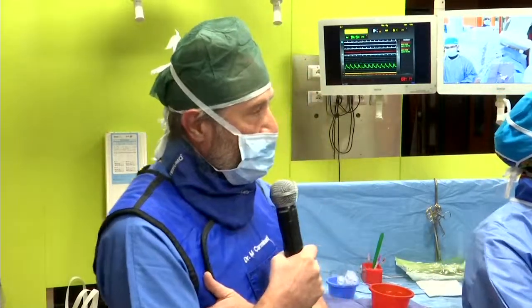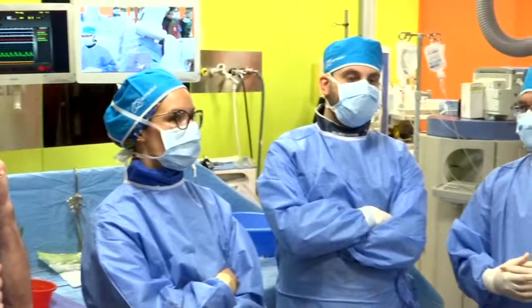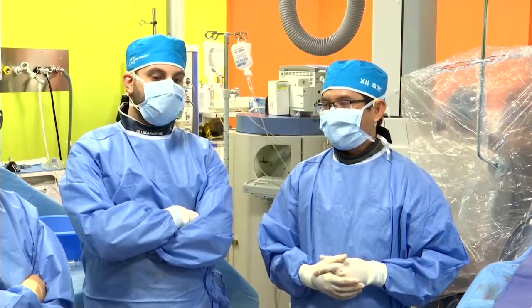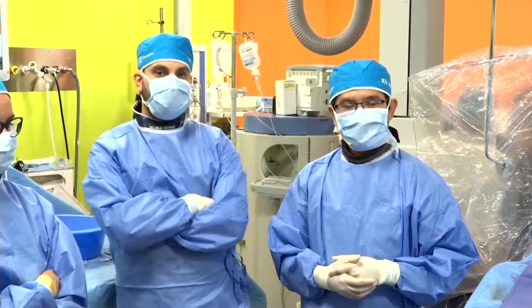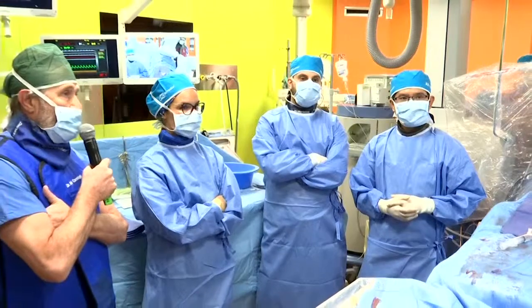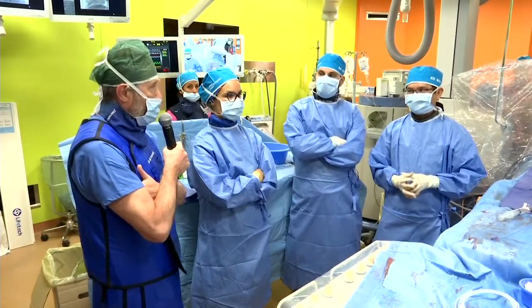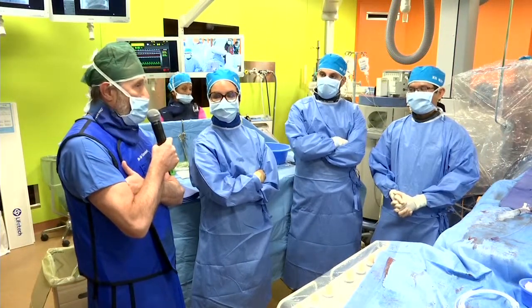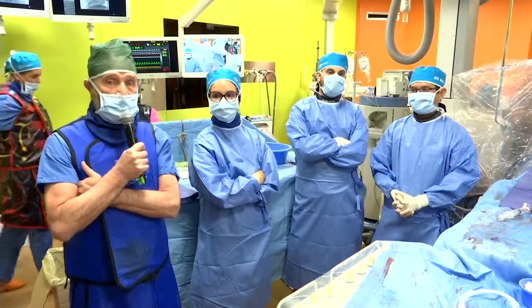Yeah, when we changed from the so-called modified device, not the Amplatzer VSD device, there was almost no AV block. I don't have any cases with AV block. Yeah, that's right. There are many devices available now, but for such an anatomy, I think the ADO1 did a perfect job. We did several cases in such anatomy, and we are very happy about that.